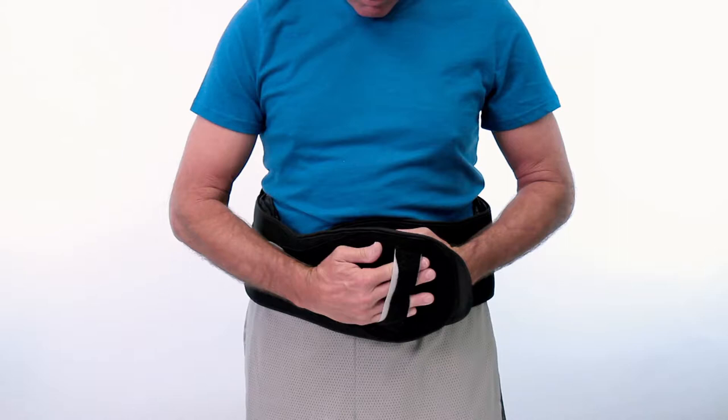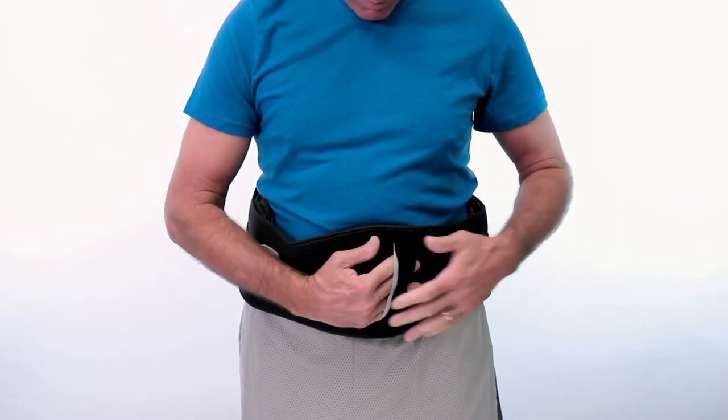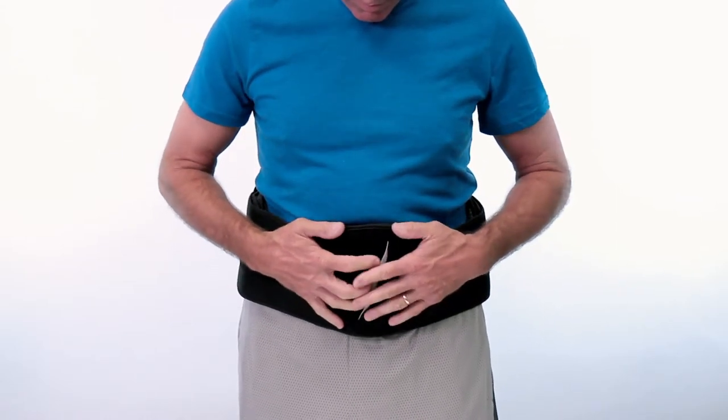To apply the brace, wrap the belt around the abdomen and overlap the right and left ends, right over left. Press firmly to engage the hook and loop closure.